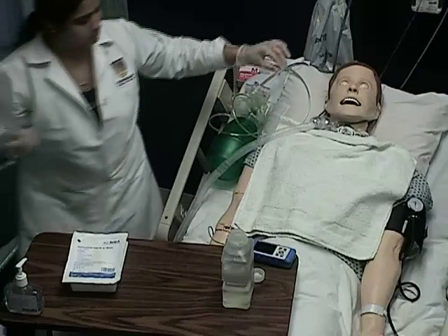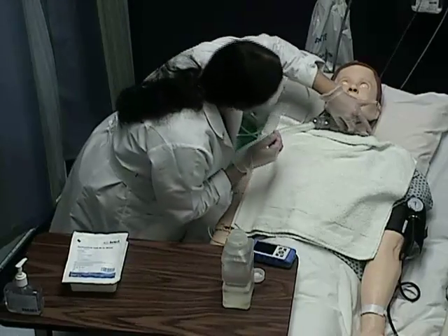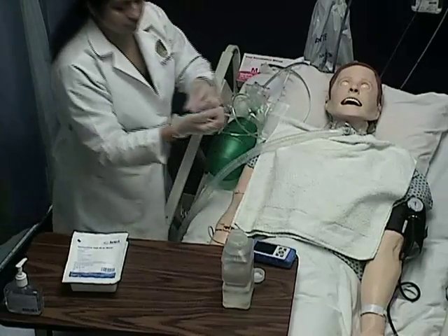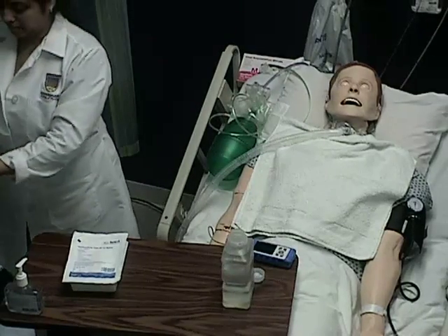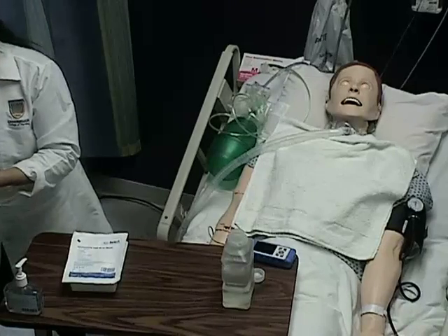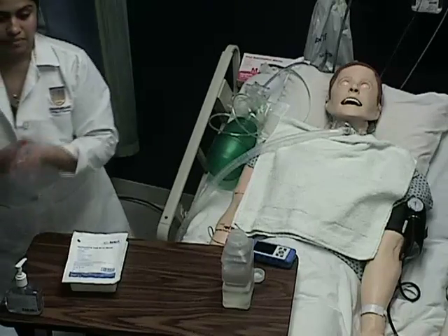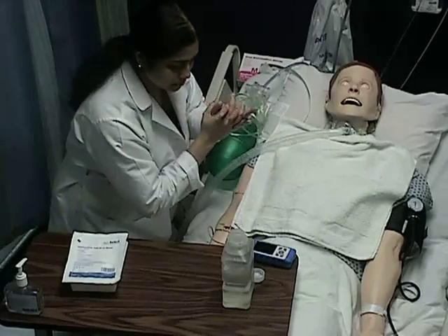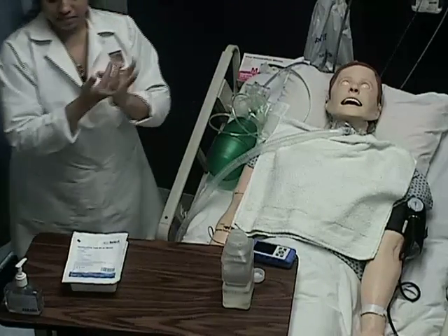You may replace the O2 device and assess patient. You can discard your gloves and perform hand hygiene. It is important to assess the patient's cardiopulmonary status. You are now ready to open your trach kit.